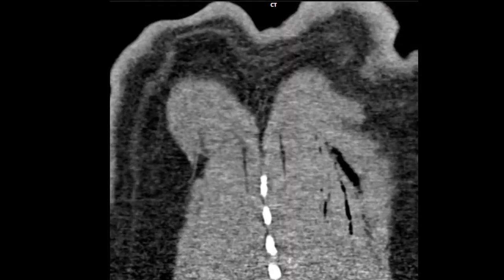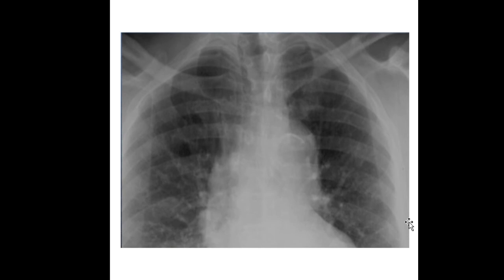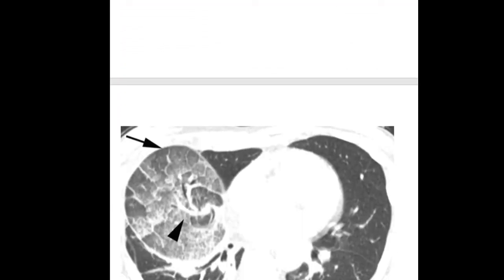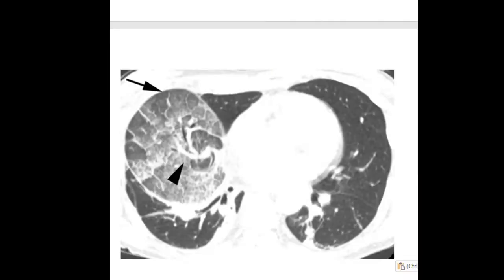Okay, a few more cases. Here's another one, chest pain. I'll say hemoptysis for this one. Oops. Apologies. Moving on to the next one. Oh, that's the last case.